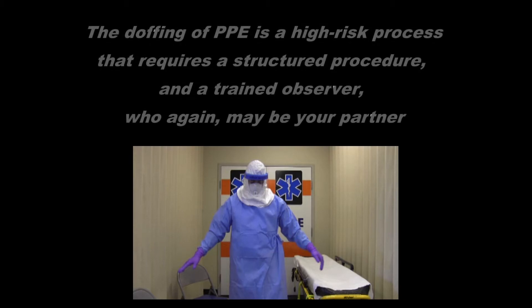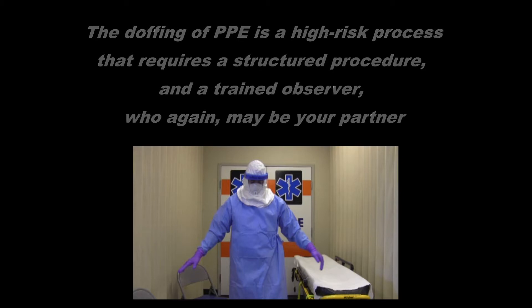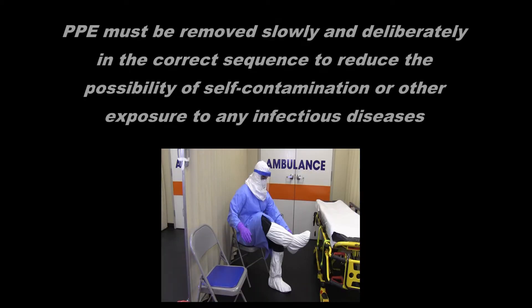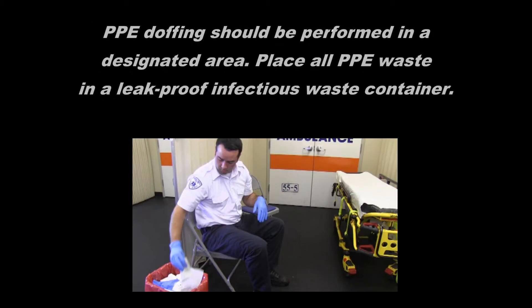Once patient care is complete, you will then need to remove or doff your PPE. The doffing of PPE is a high-risk process that requires a structured procedure and a trained observer, who again may be your partner. PPE must be removed slowly and deliberately and in the correct sequence to reduce the possibility of self-contamination or other exposure to any infectious diseases. PPE doffing should be performed in a designated area and all PPE waste placed in a leak-proof infectious waste container.